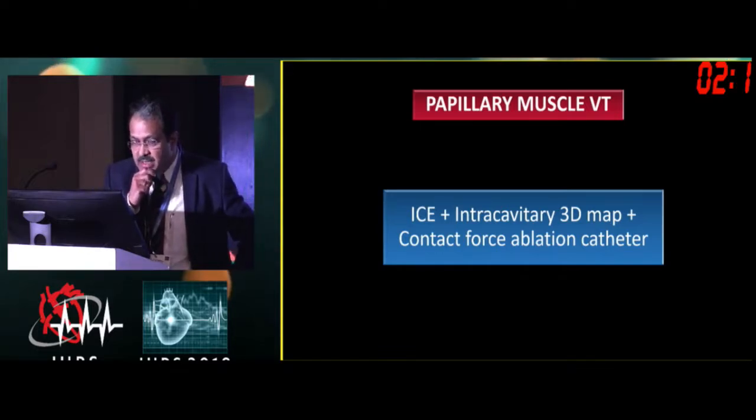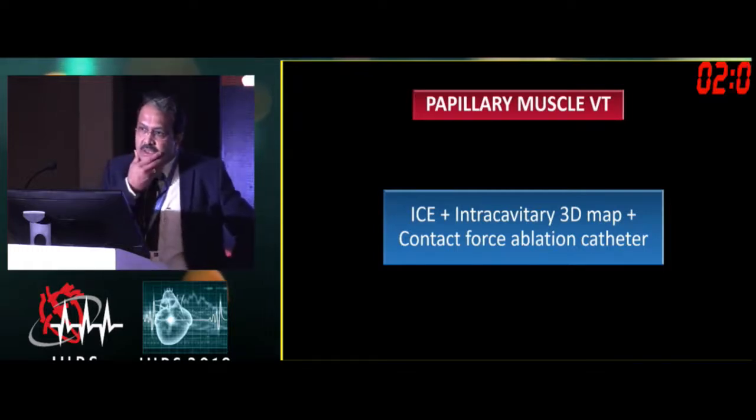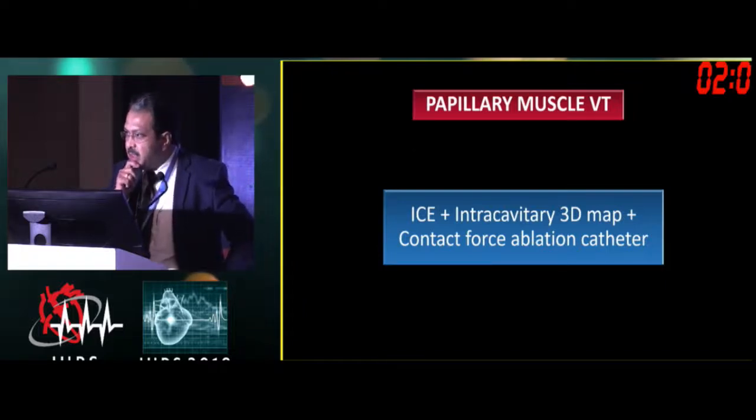Papillary muscle VT, we use ICE. But in general, over a period of time, ICE has become an integral part of our ablation procedure whenever we deal with VT or atrial fibrillation.